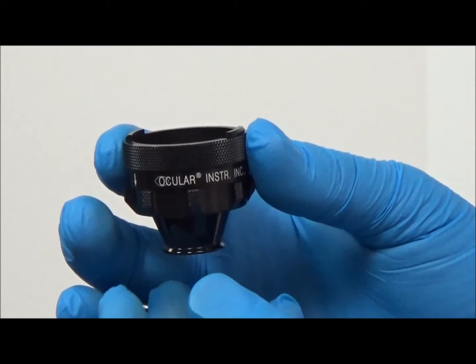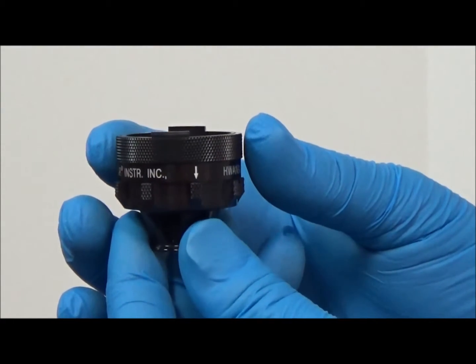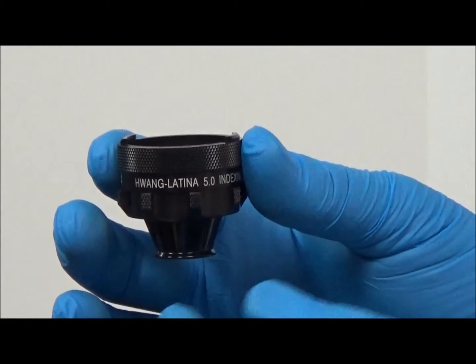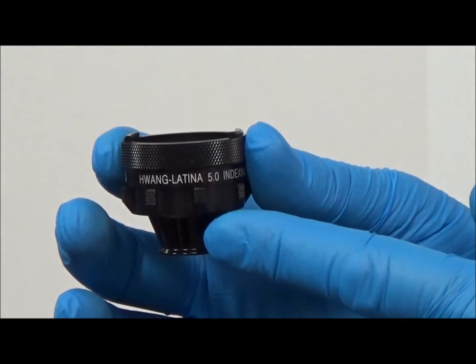The Hwang-Latina 5.0 Indexing SLT lens consists of two main parts: the anterior knurled rim and the lens with its extended knurled tabs.